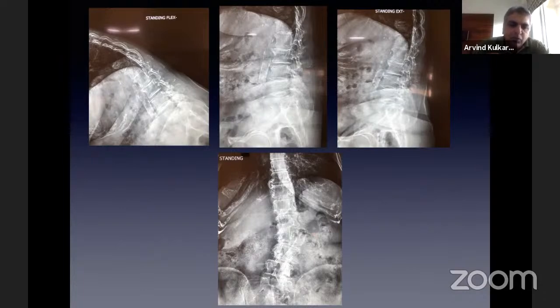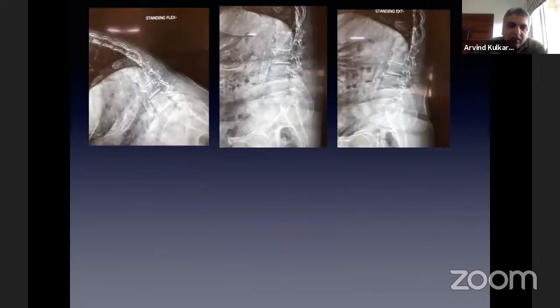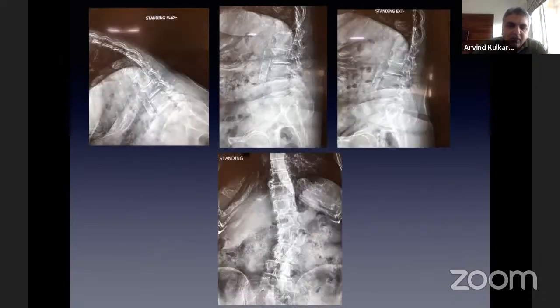If there is not much movement between the two X-rays in terms of the Cobb's angle, as well as, if you see the MRI, you can get a hint as to how the curvature is behaving. It's behaving as if it is fixed. It is not moving much even in the MRI, which is done in lying down position. So if it is stable in standing and lying down, even on positioning on the OT table, and if the patient doesn't have back pain, I would try a hand at minimal access decompression, but I would have a discussion with the patient that if it fails, she might need a fusion.